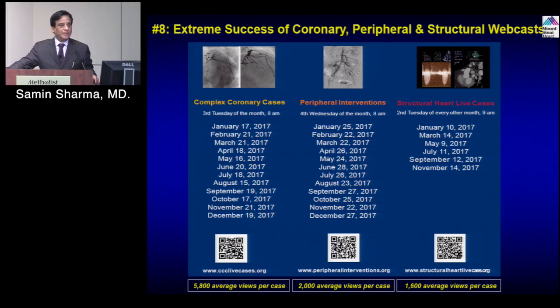So I think this is a very important question asked: what is the impact of the change in technique on the outcome, particularly now with rotational atherectomy, which has been here for 5 years, and we still don't feel great about it in terms of the long-term outcome. To me, the answer is actually there is no clear answer. We can only talk about our personal experience, that the slow flow and perforation we used to have has disappeared with rotational atherectomy by going to the slow speed.